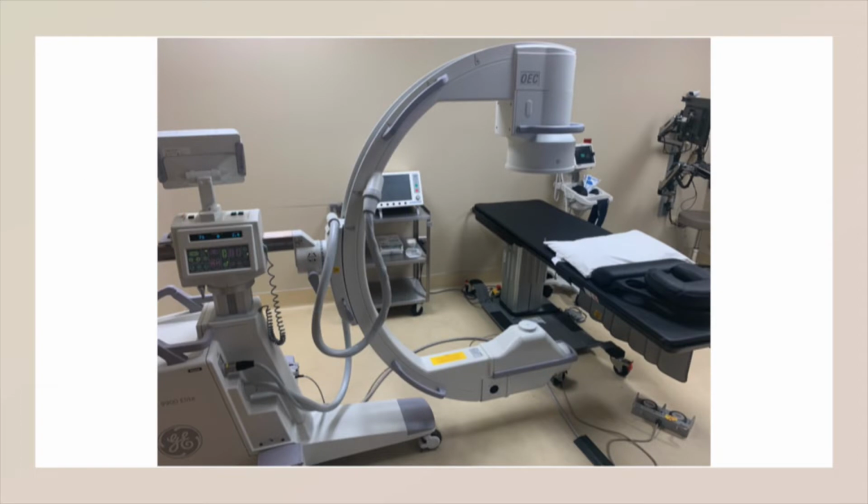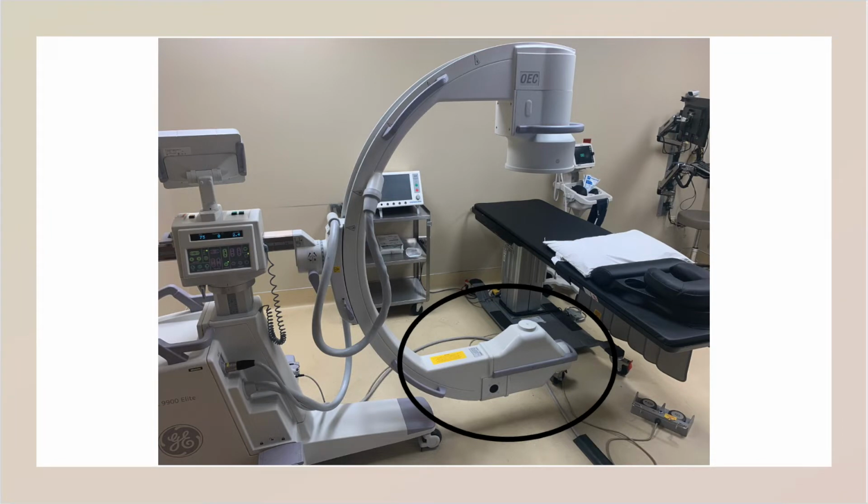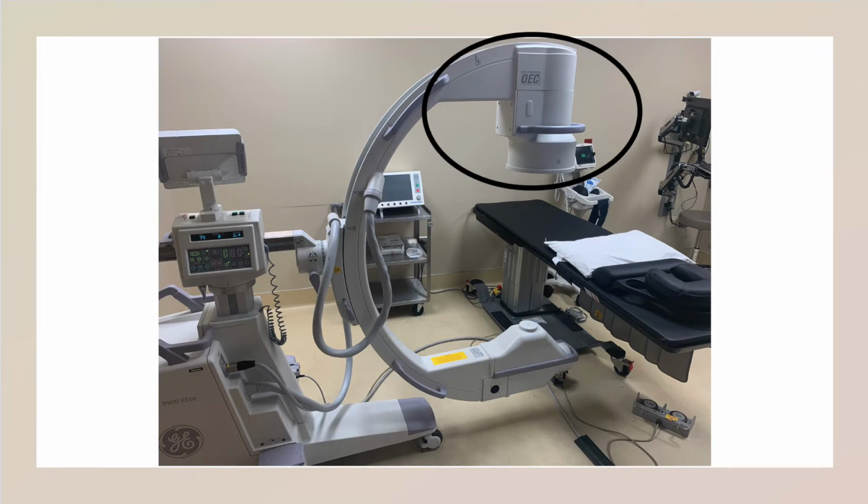This is a picture of a basic C-arm used for fluoroscopic guided interventions. The portion of the C-arm at the bottom is the source, and it emits X-rays, and this is commonly positioned below the patient. The top of the C-arm in this picture is the intensifier, and this captures the X-rays and converts it into the pictures that will be displayed on the monitors.